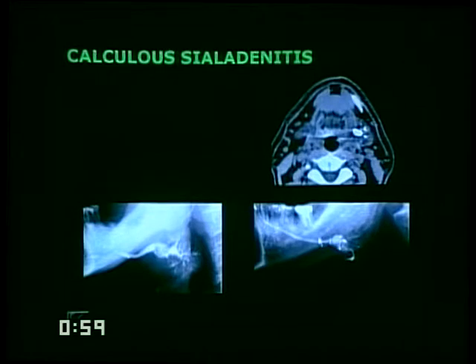of pathology. Whenever you do a sialogram, if you do them, just as you do in a myelogram, remember you've got to get a post-sialogram CT. You may or may not want to do a low-dose pre-neck CT to look for calcifications and then follow it up with a post-sialogram follow-through CT. Again, not in favor because it's rather a painful procedure.